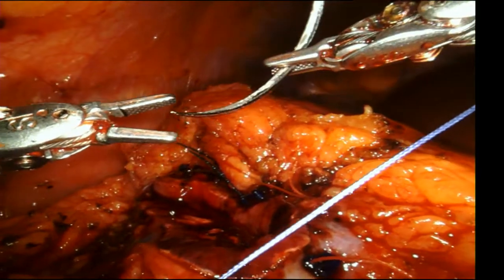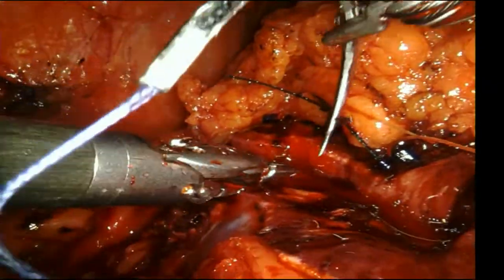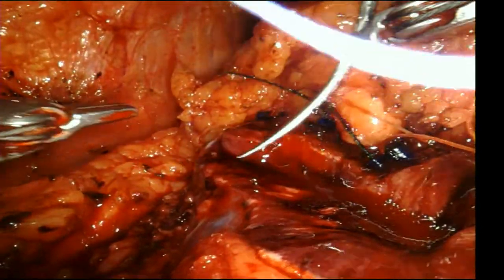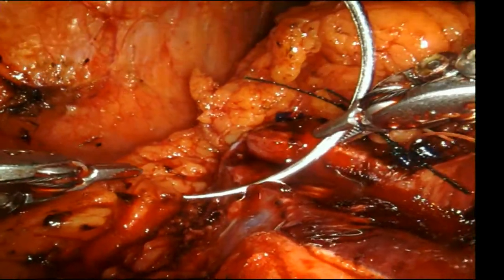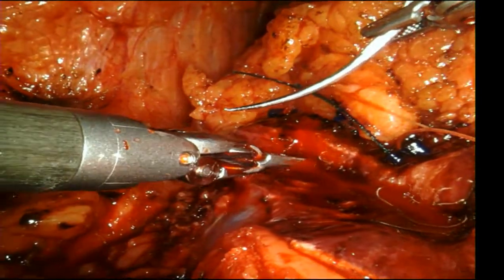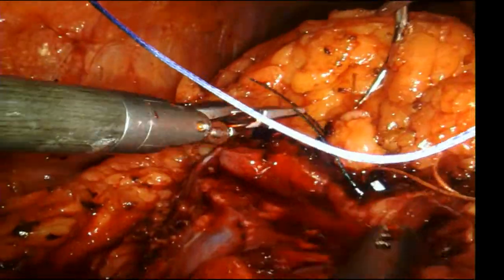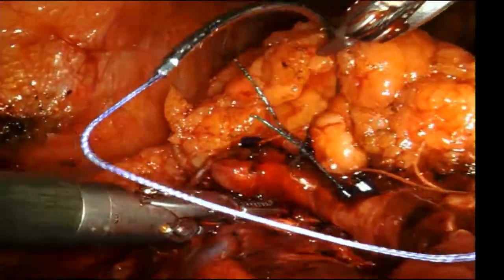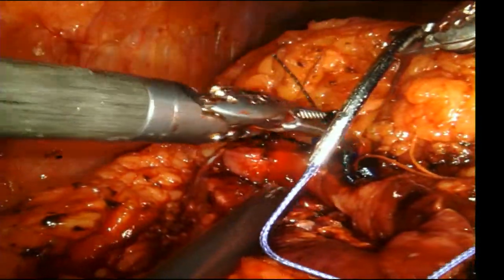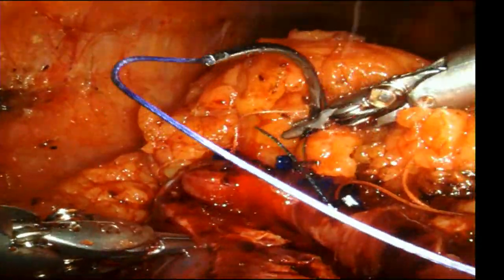I have seen this. So basically, the traditional way of doing the capsular stitches would be to go through the capsule into the defect, across to the other side, through the kidney, and then out the capsule. What I do differently is I use these larger needles, and I go deep to the entire defect and come out the other side. Then I line them up like this. When I squeeze them, I'm not just bringing the capsular edge together, I'm squeezing the entire depth of the tumor bed so that it won't bleed or leak urine. The depth I'm shooting for on these stitches is the same depth as my initial stitches so that I'm not killing any additional kidney by doing this. I'm going at the same depth of that original deep layer.